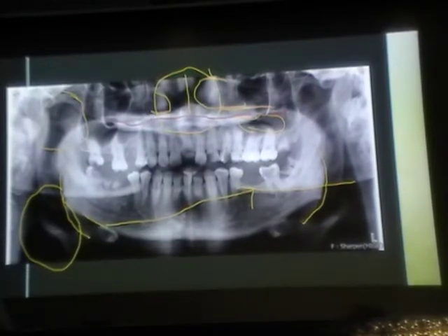Any questions, guys? Yes, ghost image of the cervical vertebrae. That's what you're seeing. On the side, the middle. Yeah, inferior alveolar canal, also called the mandibular canal.